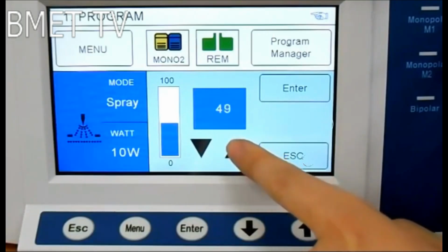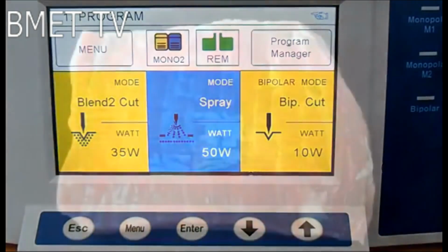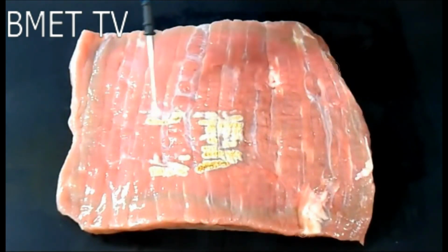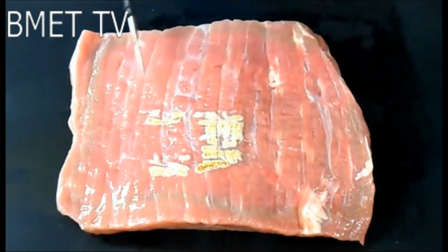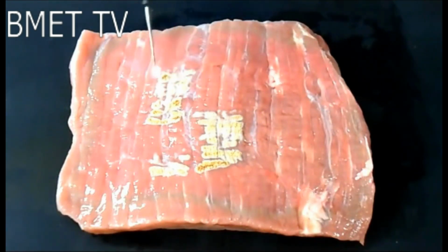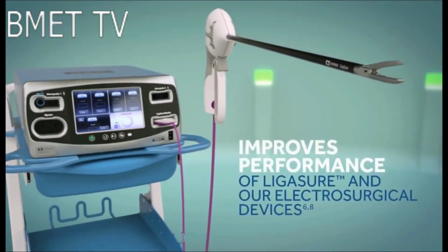The third mode is fulguration mode in electrosurgery. In fulguration mode, the electrode is held away from the tissue so that when the air gap between the electrode and the tissue is ionized, an electric arc discharge develops. In this approach, the burning to the tissue is more superficial because the current is spread over a tissue area larger than the tip of the electrode. Under these conditions, superficial skin charring or carbonization is seen over a wider area than when operating in contact with the probe, and this technique is therefore used for very superficial or protrusive lesions such as skin tags. Ionization of an air gap requires voltage in the kilovolt range. Three tissue effects are possible with today's electrosurgical units: cutting, desiccation, and fulguration.